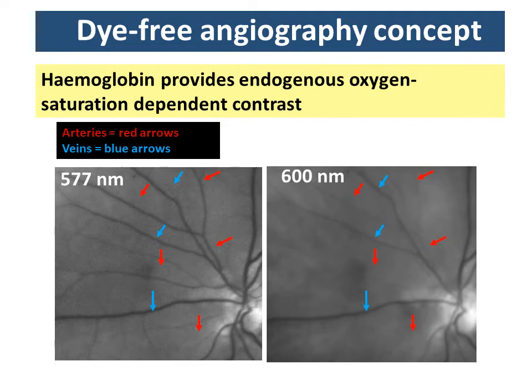Well, if we look at an oxygen-sensitive wavelength with lots of contrast between oxygenated and deoxygenated blood, such as a 600 nanometer waveband, I should say this isn't purely 600 nanometers, there's some longer wavelengths in this particular waveband, so arteries are very transparent here. And you can see the big difference in absorption between arteries and veins, and this is, of course, due to blood oxygen saturation and the difference in oxygen content that this makes. So the idea is to use this difference in optical absorption, but we need to perturb it somehow to change it and watch that oxygen perturbation flow through these vessels.